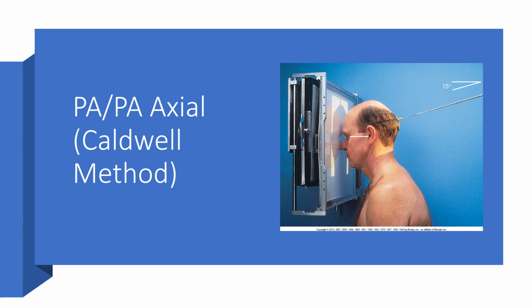That is, turn on the laser light, line it up to the image receptor. So we kind of do the positioning backwards here. We don't really center to the patient's anatomy. The central ray is described as exiting the nasion.